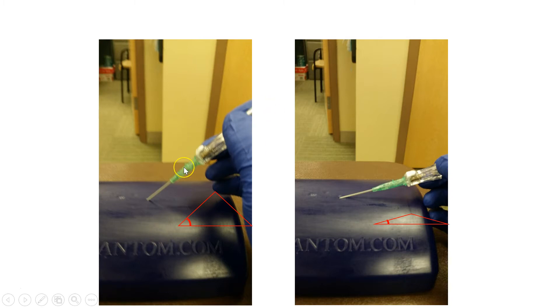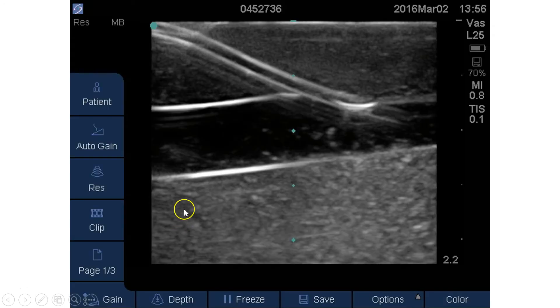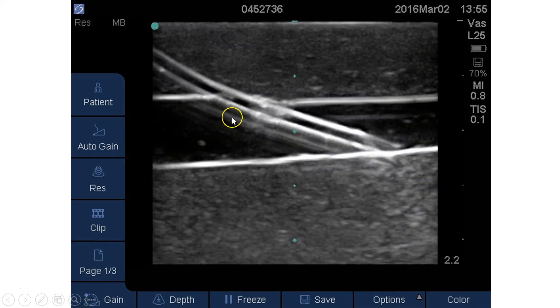The other thing to think about is doing a steep angle of attack. You want to ensure that your angle is at least 45 degrees, if not more — that gives you the best likelihood of having enough catheter in the vein. If you stick shallow at about 15 to 20 degrees, you'll run the entire catheter all the way down and run out of it by the time you reach the vessel. If you stick steeper, you find that you leave a significant amount of catheter in the vein, which is far less likely to infiltrate or fall out.